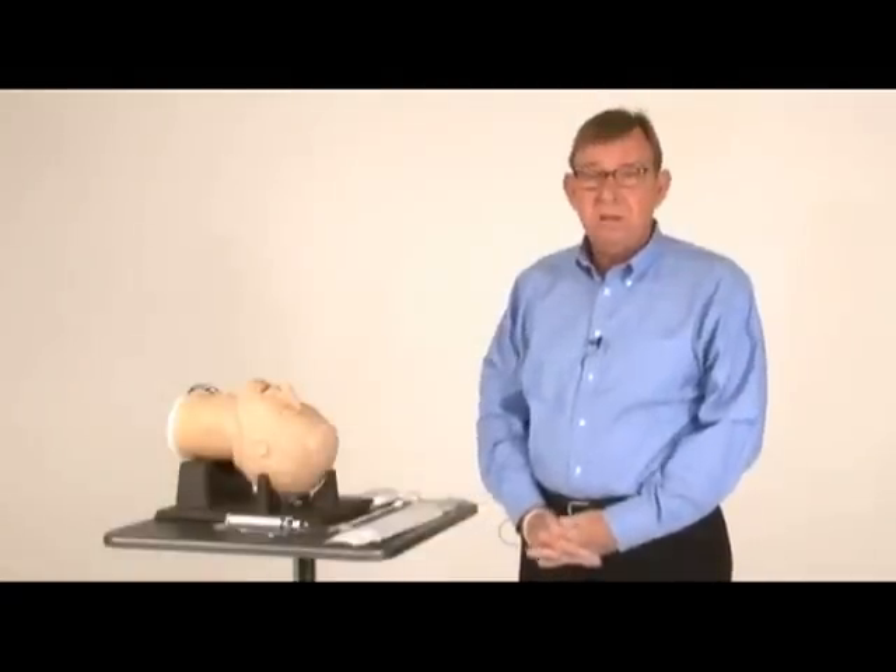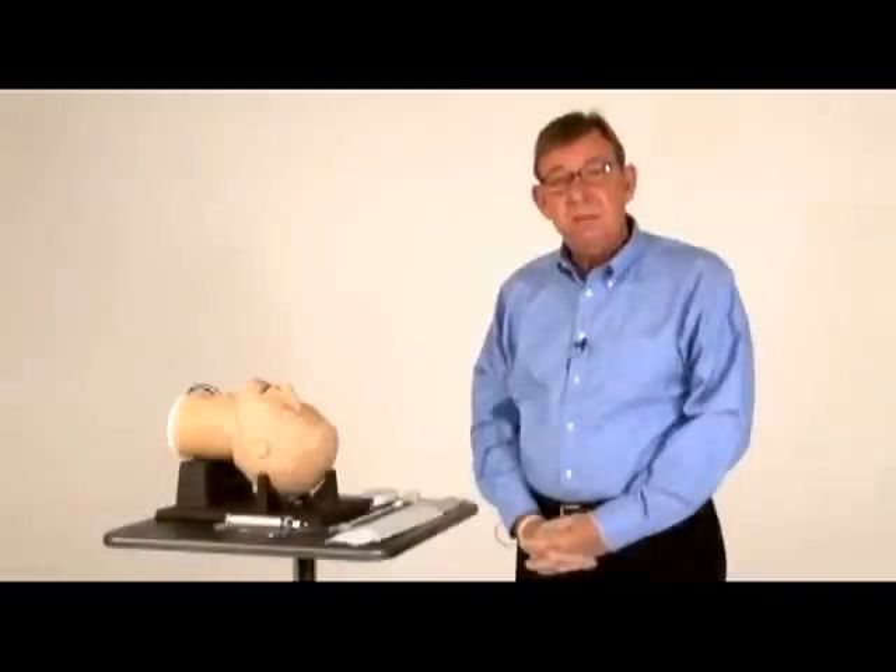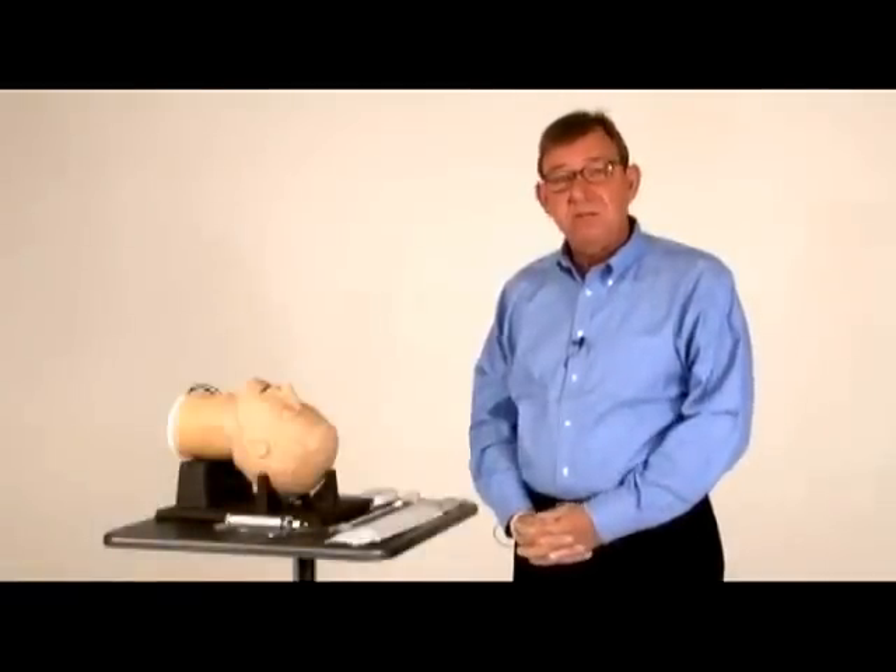My name is Dan White. I'm a paramedic and I write the EMS Technology column, Insights on Innovation, for paramedictv.com and ems1.com. Today I'd like to introduce you to the ViewStick.